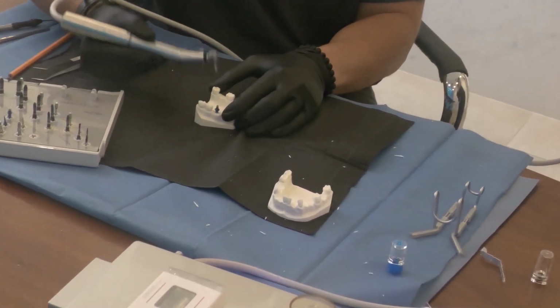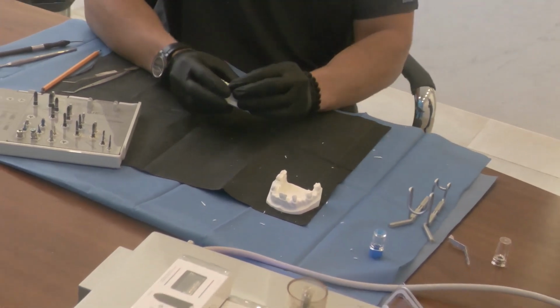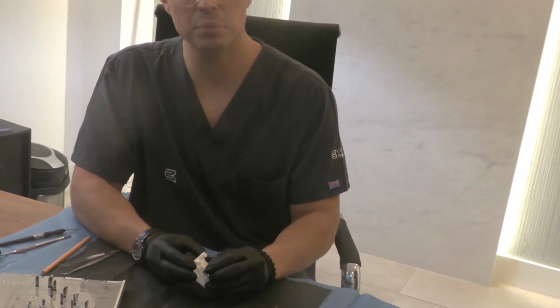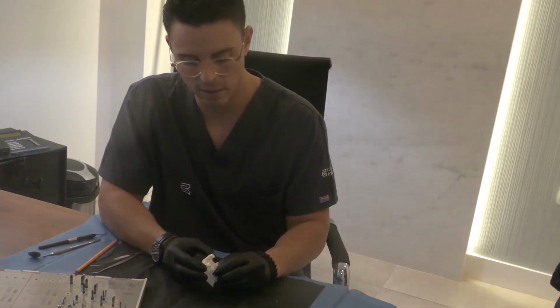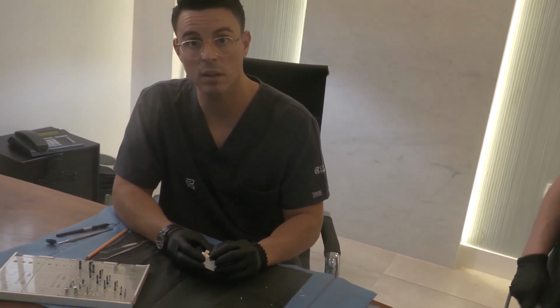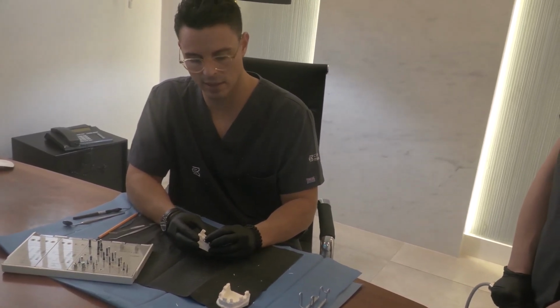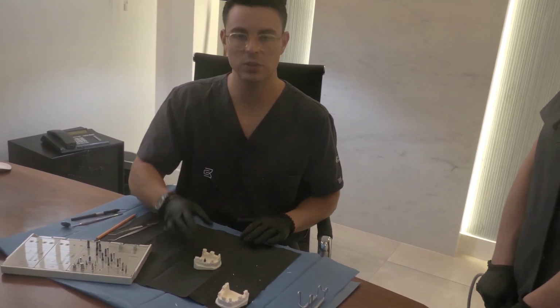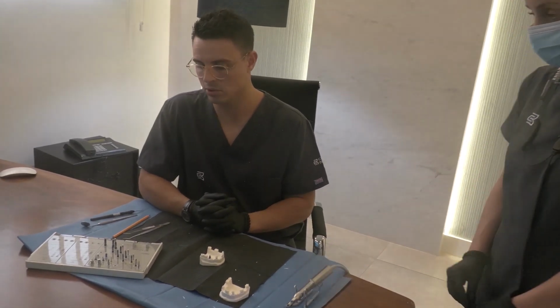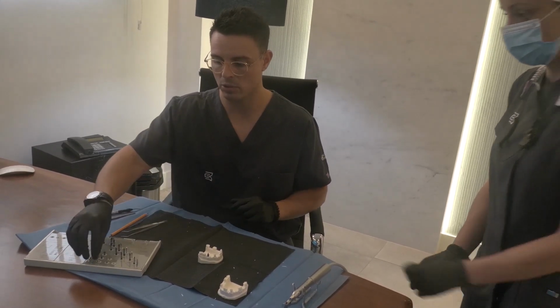There we go. In order to guarantee the placement of the prosthesis on top of the implant subcrestally, and together with the gap zero, with the minimal bacterial infiltration in the gap in between the crown and the implant, I'm confident that this will result in a minimal to no bone remodeling process, which in the long term will be translated into minimal risk of biological complications.